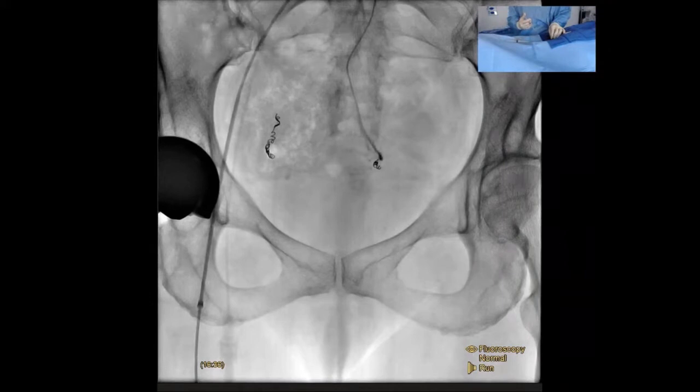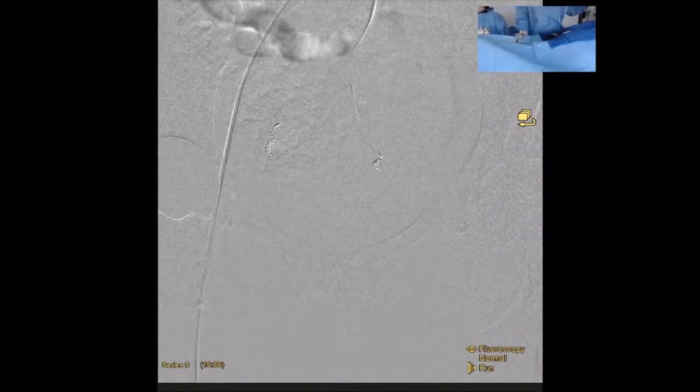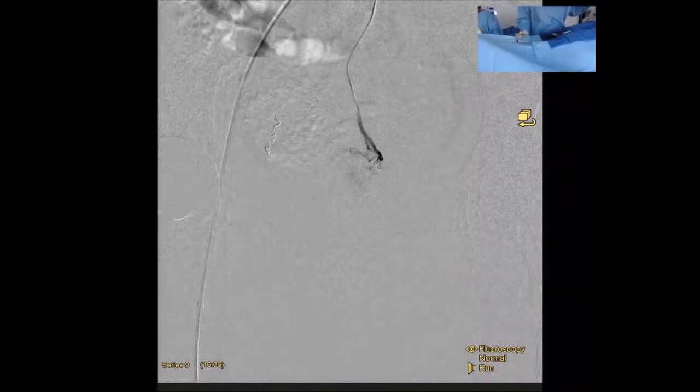Oh, look at that. All right. No, that's a good thing. The two of us were eating our words. Well, it must be just the interlock coils. Look at that. Yeah, fibers. Actually, it does speak to a really nice thing, I'd say.